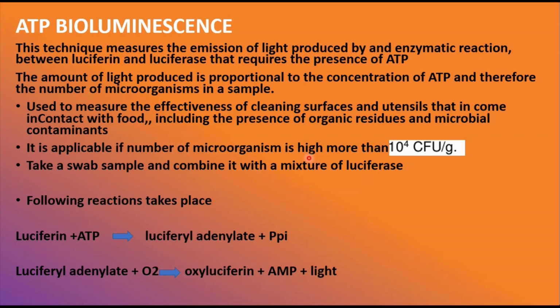Technically, the ATP luciferase reaction emits what we call light, which is measured immediately with a liquid scintillation spectrometer or luminometer. The main advantage of this method is that it is one of the simplest and most rapid ways to measure the ATP level in a food sample, and hence it is helpful in estimating microorganisms in the food and food products, mainly those that come in contact with the food.